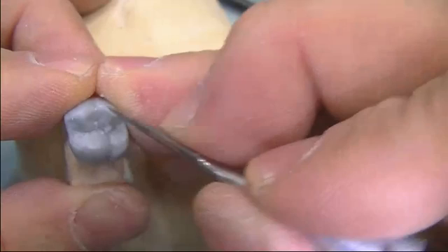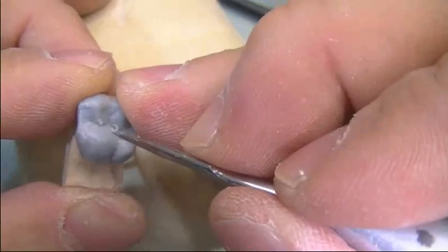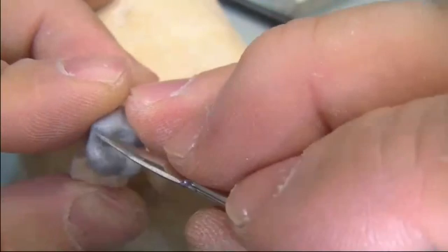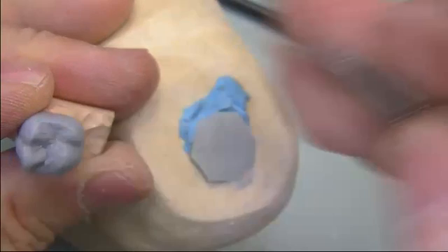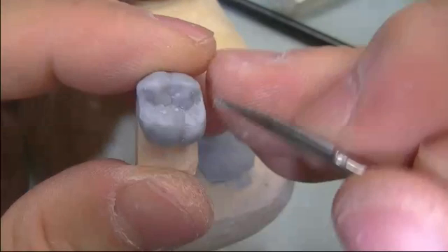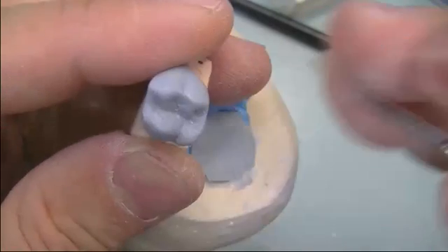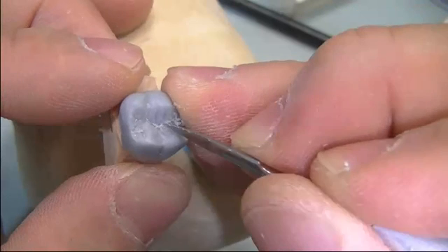For carving, we remove the die so it's easier to handle and flip around. Using the sharp edge carver, we put in the grooves — S-shaped grooves rather than straight line grooves. Generally, you carve out the occlusal morphology and the details. It's quite easy if you can memorize the way the groove flows.